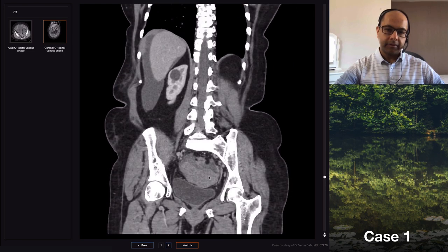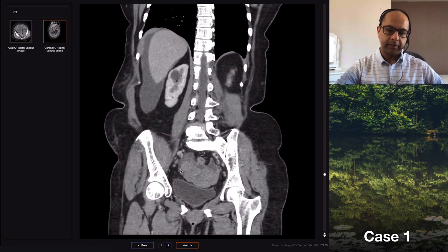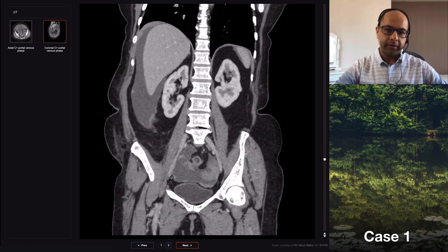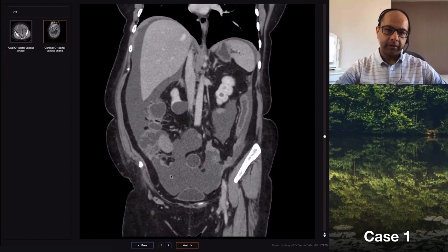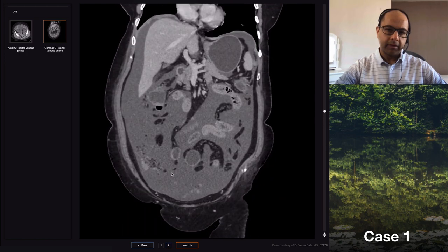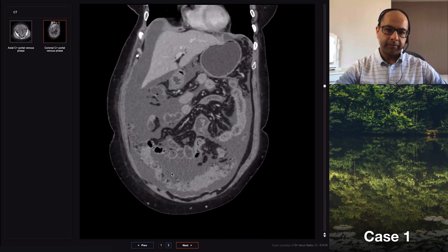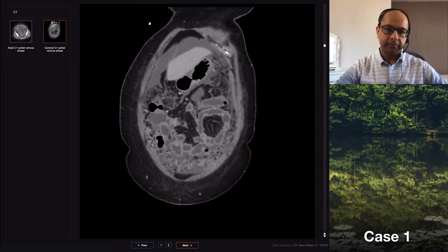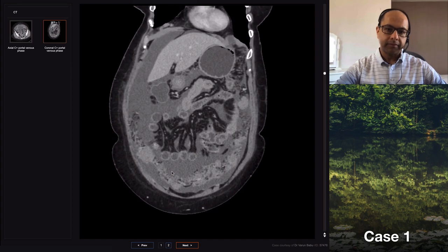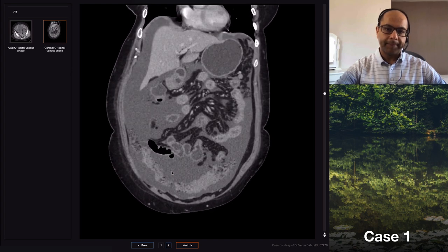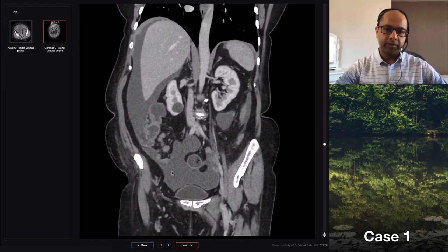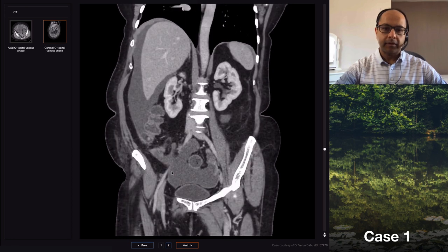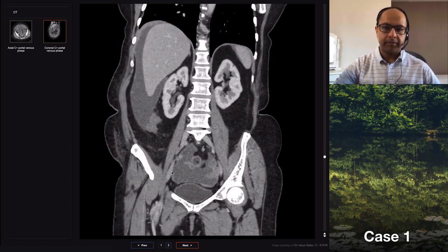Looking at the other structures, the liver hasn't got any negative points. No evidence of cirrhosis of the liver. I can't see any gross bowel lesions or tumors. No gross lymphadenopathy. My differential would be a right ovarian malignant cyst.